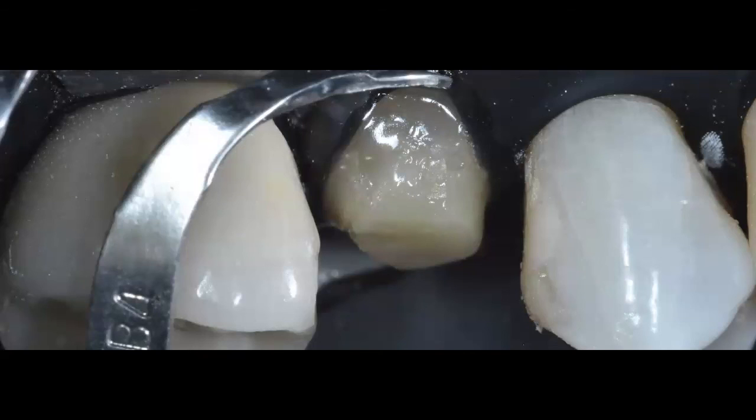I want everything to be nice and round. I don't want any sharp angles. I just want my restoration to fully sit and to bond to this core, which is really what's going to keep this restoration in place. Now, is this a bulletproof type of restoration? Is this never going to fail?